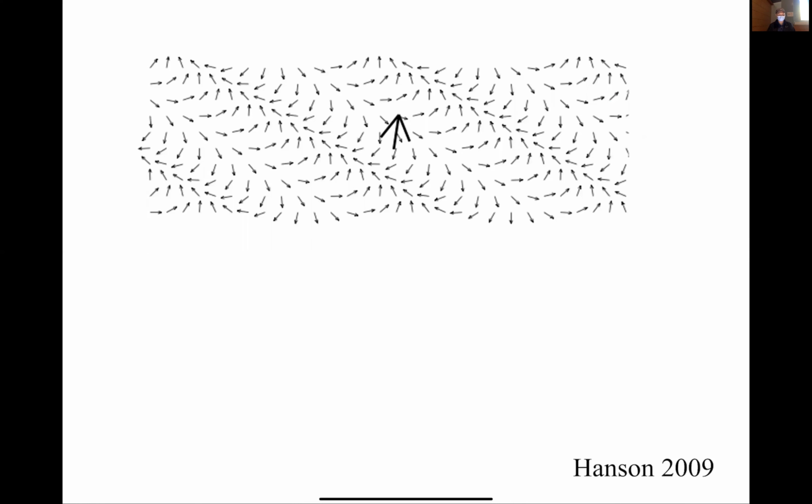Here the object is, let's assume, some uniform object in the shape of, let's say, a bar of chocolate. We put it in an MR scanner, and at one point in time, we've got this spatial pattern of the phases. You can see this is a diagonal spatial component, with these lines of constant phase, of equal phase, being diagonal. And then what it's saying is now sum up all the spins in that volume. That's integration. And if I do that, I would get this arrow here.